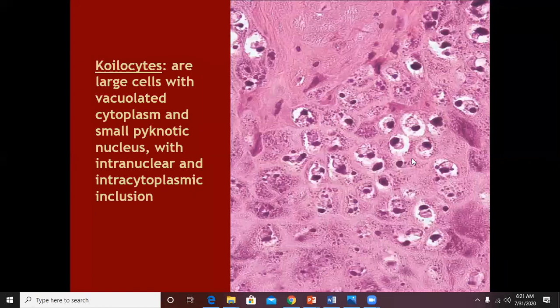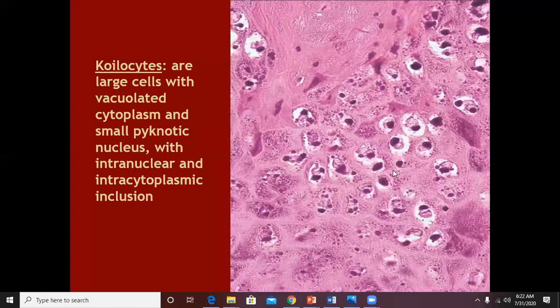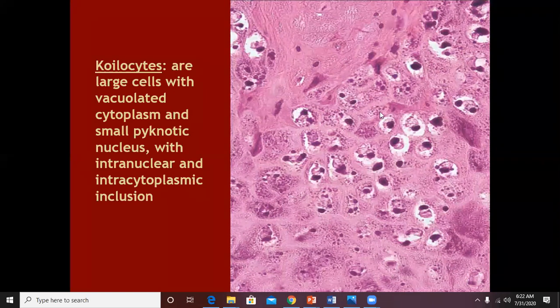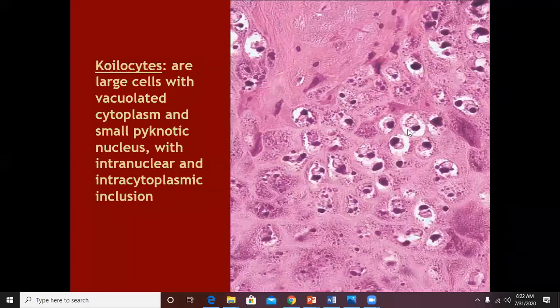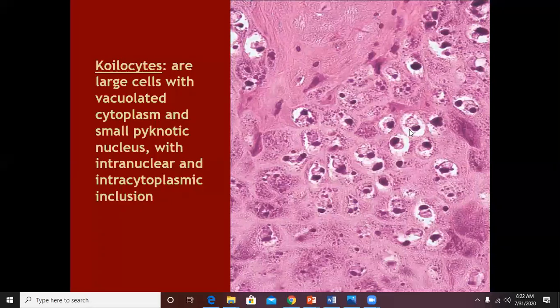So in the middle of hypergranulosis, hyperkeratosis, and papillomatosis, if you see vacuolated or halo-type cells with abnormal or pyknotic nuclei, you will call them koilocytes and diagnose the condition as a viral wart.